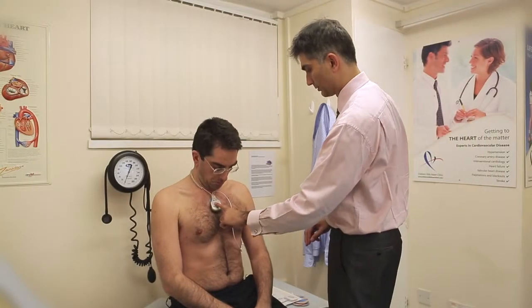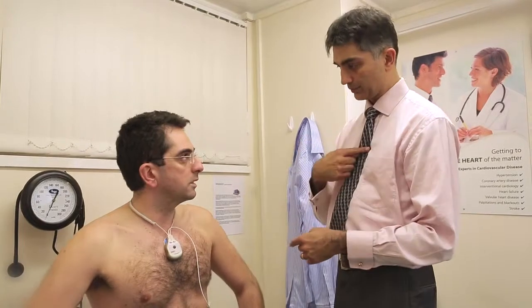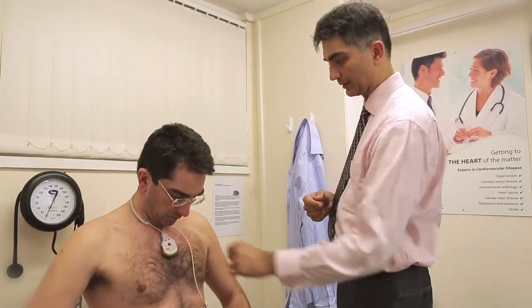The monitor is usually fitted in the clinic room. The electrodes are attached to the patient, usually two electrodes on the chest of the patient, and the workings of the monitor are explained.